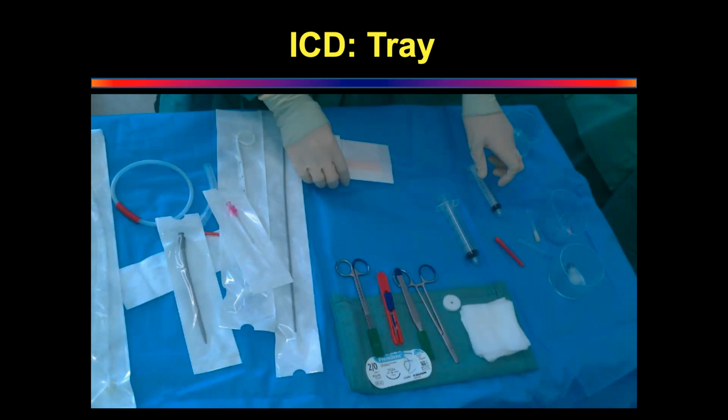Then what do you do? You've aspirated. Yes, once we have confirmed the entry with a gush of fluid, we insert the guide wire into the space. Once the guide wire is inserted, the needle is... How do you mount a guide wire? What do you mean by mounting a guide wire? Sir, there is a small nozzle kind of a piece on the guide wire roll, which you put on the needle, which fixes it.